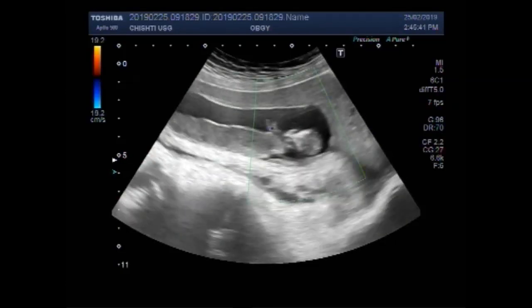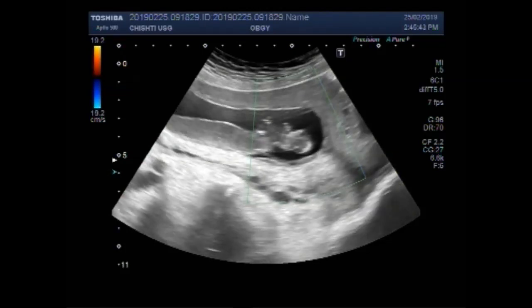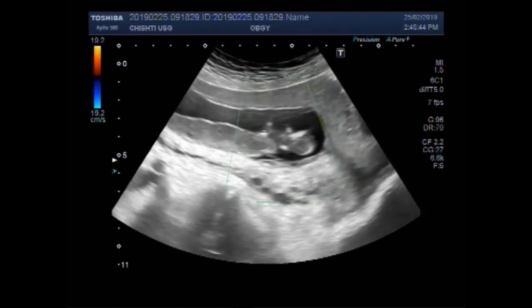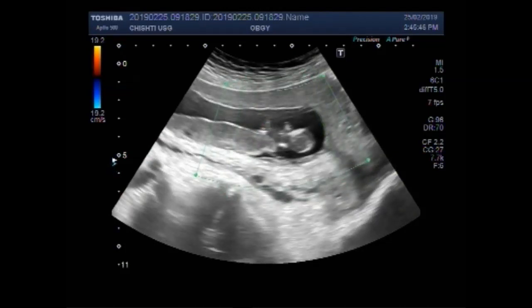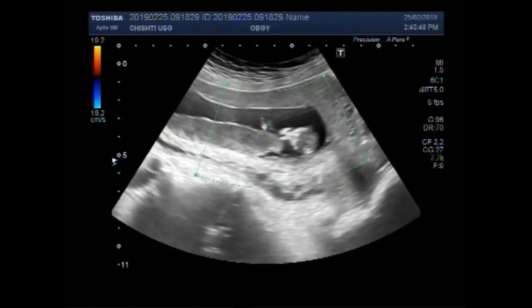Now you can see there is no blood flow seen inside the uterus, inside the gestational sac, or inside the fetus.